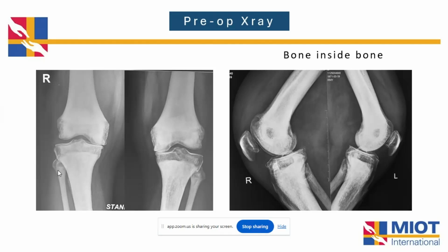I use the same instruments for all cases, irrespective of age, gender, anything. You are correct, sir. We have to avoid intramedullary drilling.